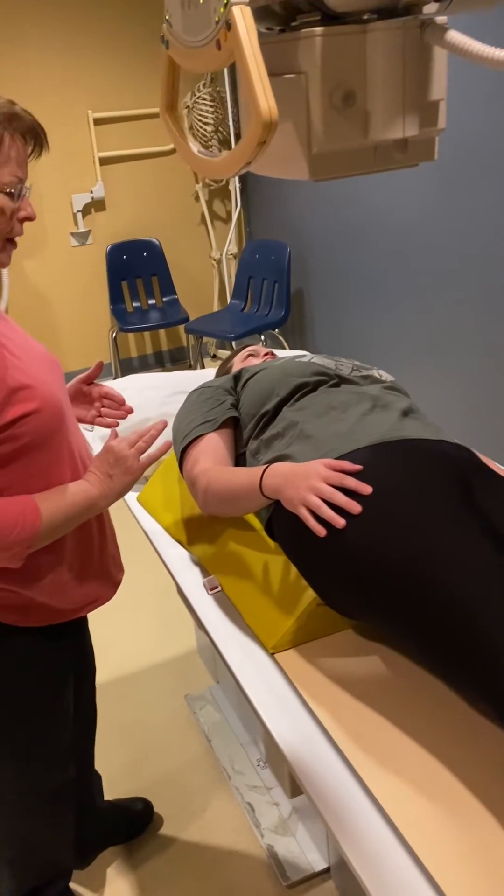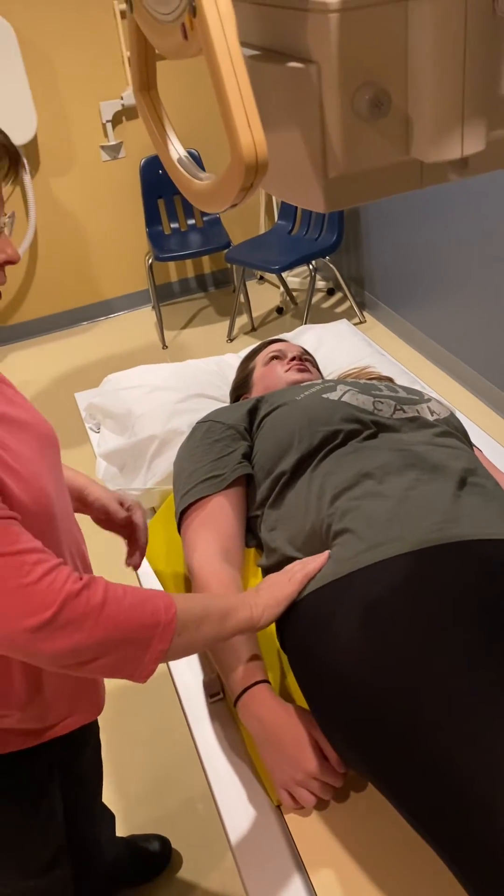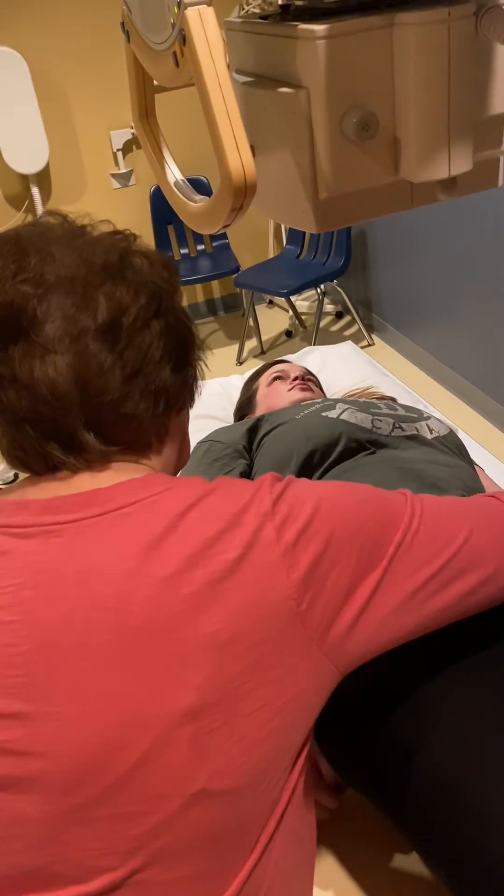This is at the level of crest, so that's good. I'm just going to have you put your hand right there — so find the crest. Level of crest.